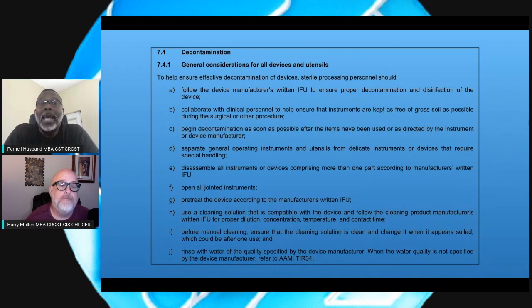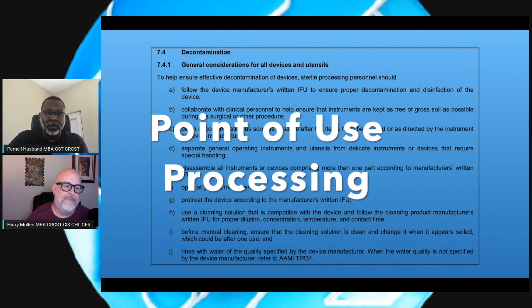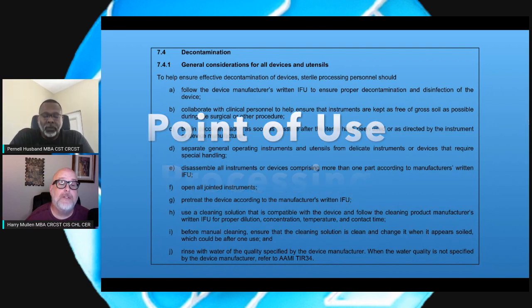And B, Mr. H, collaborate with clinical personnel to help ensure that instruments are kept as free of gross soil as possible during the surgical or other procedure. Now, we all know and understand that surgical technicians are taught, and an expectation of them is that they keep the surgical instruments free of gross soil during the actual procedure or surgery. There's a saying in the operating room world: decontamination starts in the OR. Critically important. Absolutely. Starts at the point of use. Absolutely.